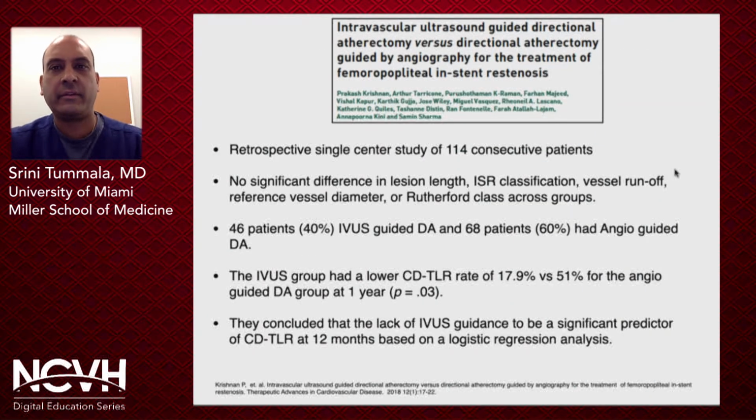Here's another study of IVUS related to directional atherectomy. Most of us do angiography on a daily basis, and usually our directional atherectomy is guided by angiography alone. But this is a retrospective study, 114 patients by PK and his team at Mount Sinai in New York. And they showed that of the 46 patients who had IVUS-guided directional atherectomy, they had a significantly lower clinically driven TLR rate of 18% versus 51% when it was guided by angiography alone. And this was at 12 months.